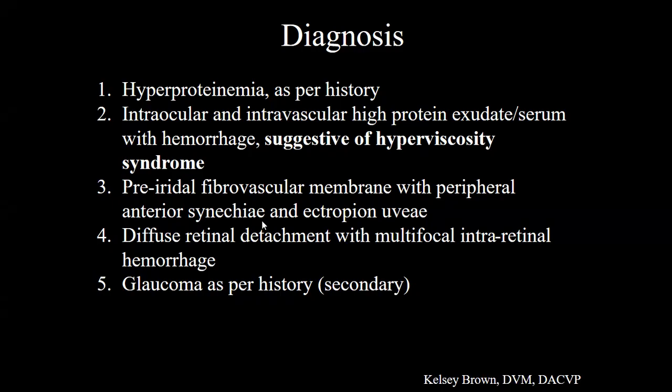So the key here is that we have a similar hue of serum in the choroidal and peripapillary blood vessels, or well, any blood vessels it should be, but definitely we see it back there. And that would indicate that the serum in the blood vessels is a similar protein content to the stuff that's in the eye, and obviously that's very subjective. So we look for these other features as far as like necrosis and things like that.